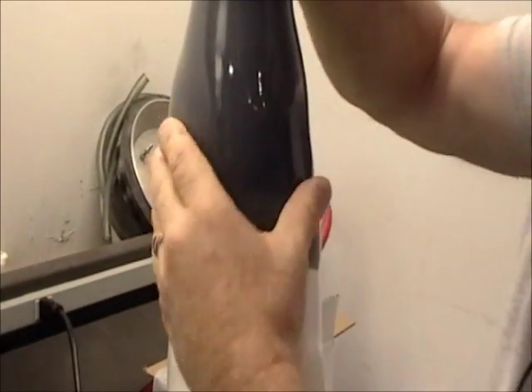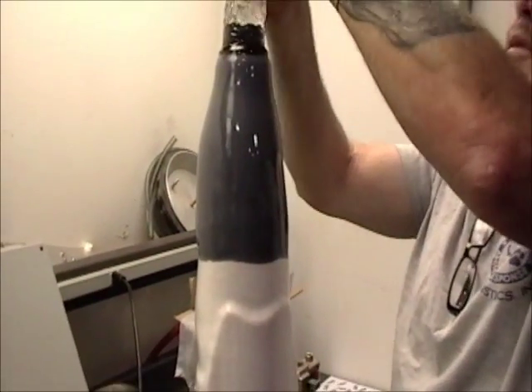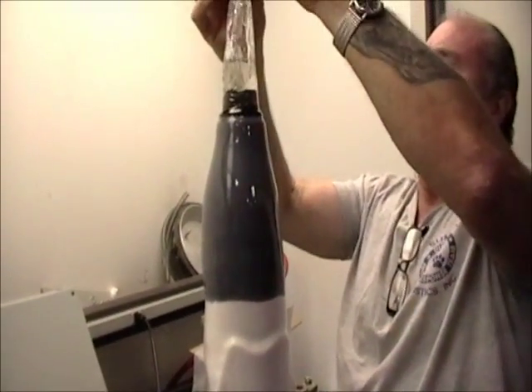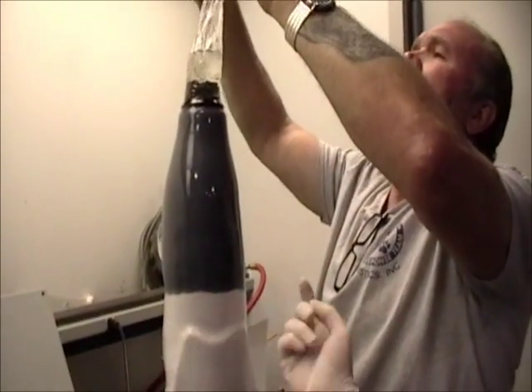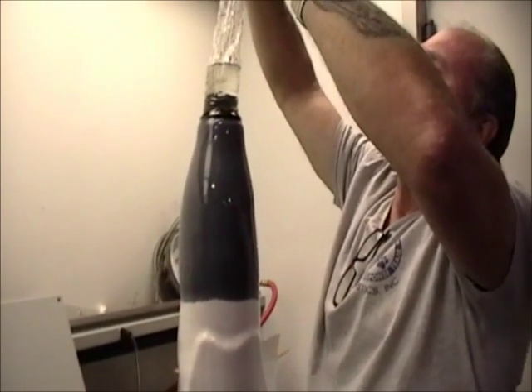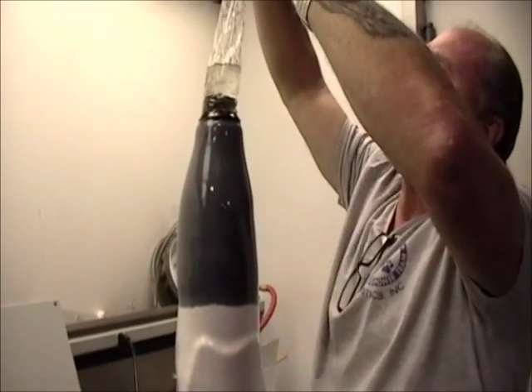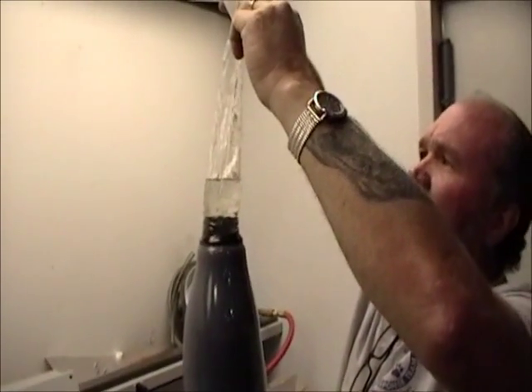Basically, you're just trying to make it a uniform distribution as it lowers. Exactly. He's keeping it really consistent all the way around. You can't really do that with an eye on it. Your hands should tell you where the resin's at.